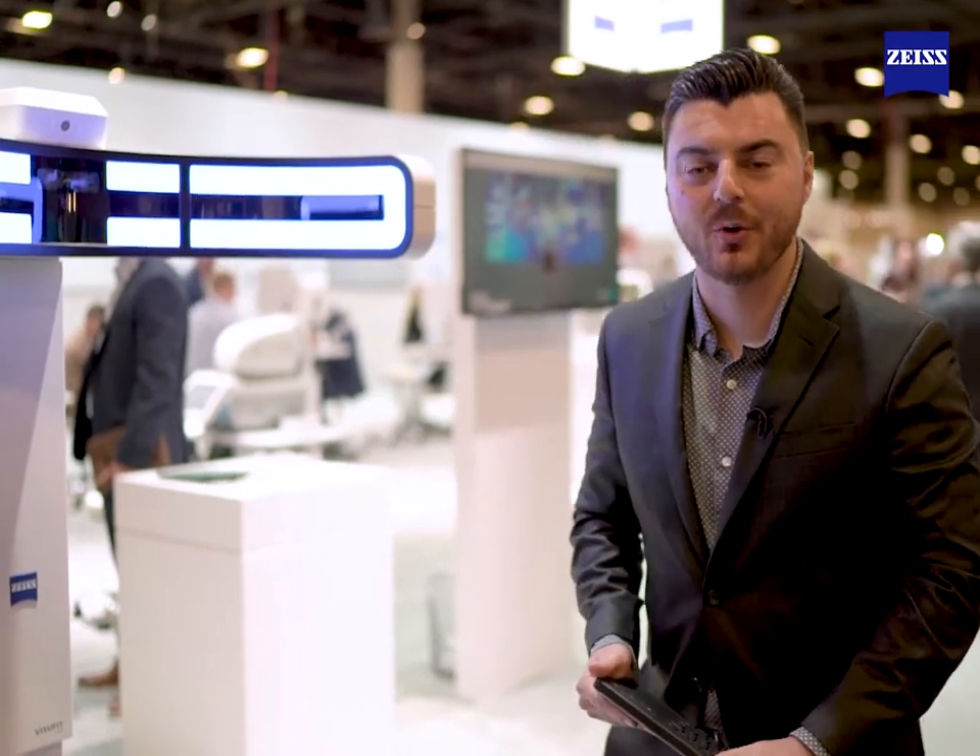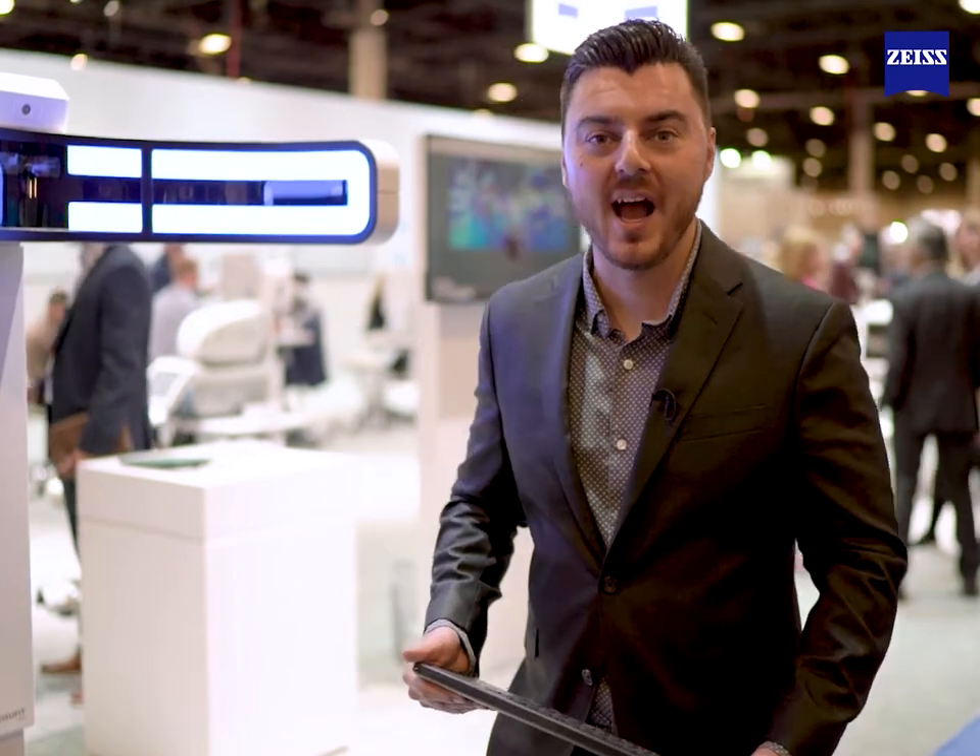We use nine cameras to capture 45 million data points. What that means to you is increased accuracy. You're going to have some really great outcomes with our device.